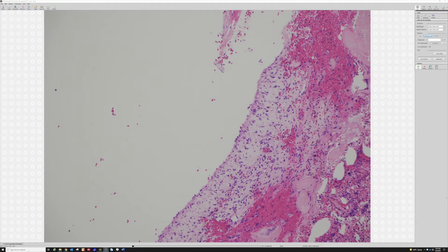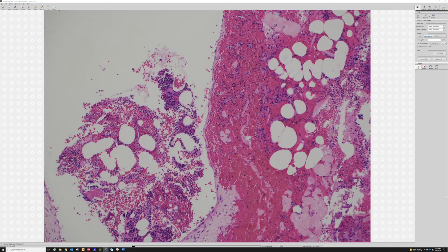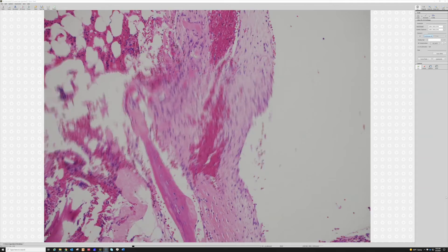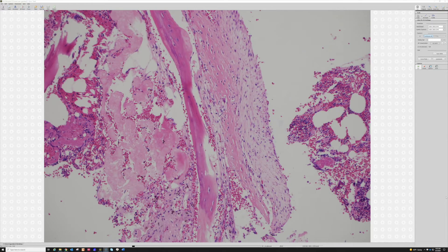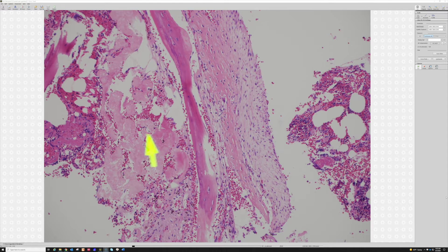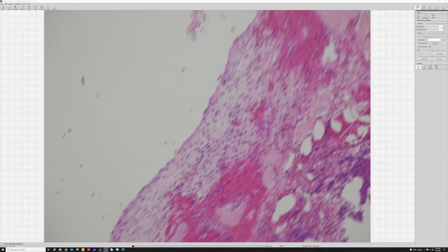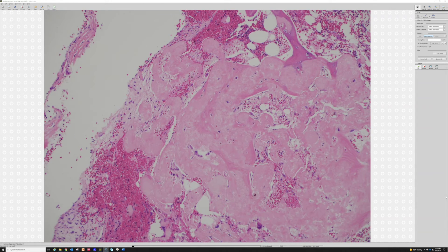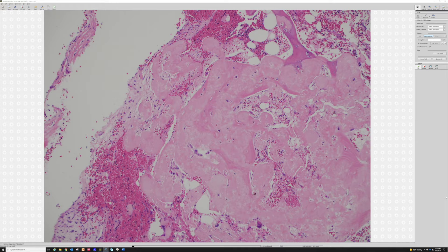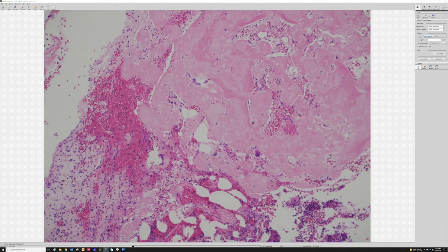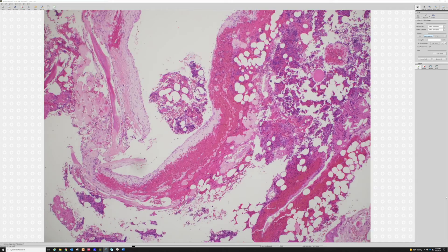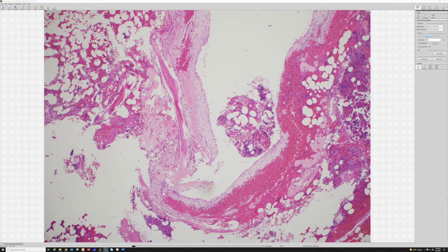It almost looks like it's doing that synovial metaplasia thing you sometimes see around a breast implant capsule — it vaguely reminds me of that — but there's no real true lining, just a thin rim of fibrous tissue. In that lining you often have this dense, homogenized pink stuff, ranging from looking like fibrin on one end and then beginning to compress and almost look like it's turning into osteoid or bone. It looks very smudgy, homogenized, and eosinophilic, then begins to transition into stuff that looks more like actual bone. This is characteristic of a solitary bone cyst.